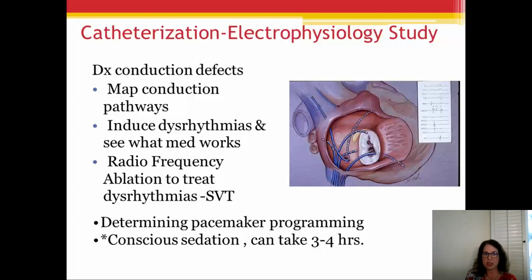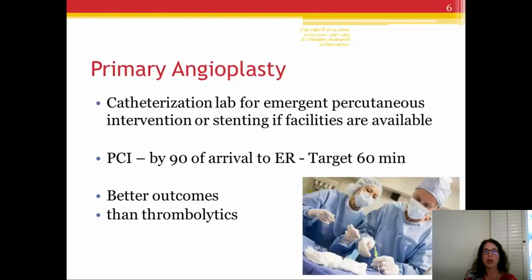Back to conscious sedation, they're not under anesthesia, they're very heavily sleepy, and so you have to carefully watch their breathing and their blood pressure status. And like I said, it can take literally 3 to 4 hours. Then the primary angioplasty is catheterization lab for emergent percutaneous intervention or stenting if the facility also has that available.